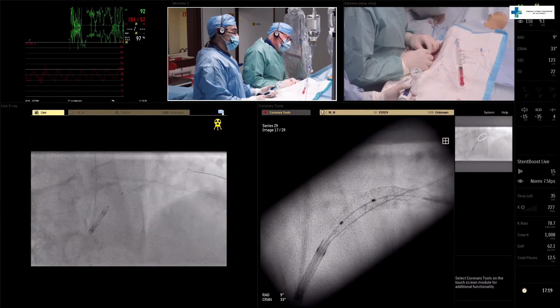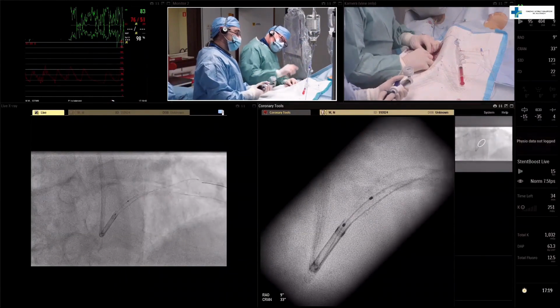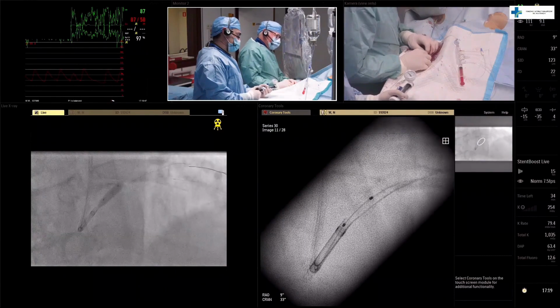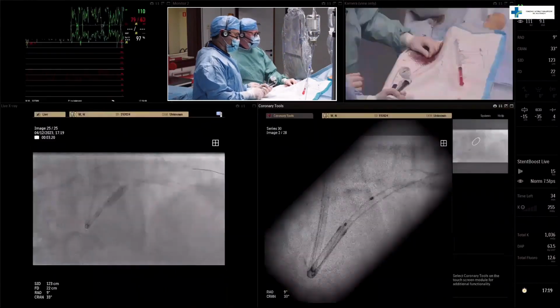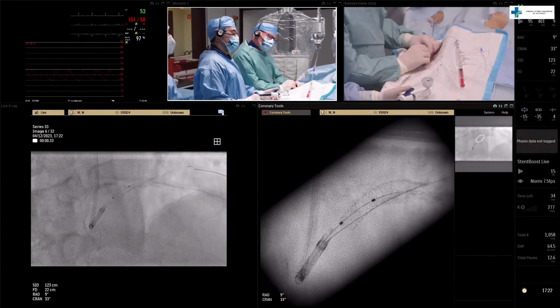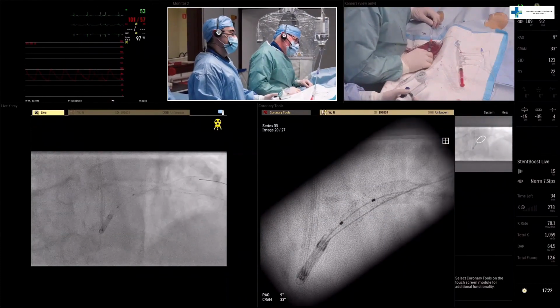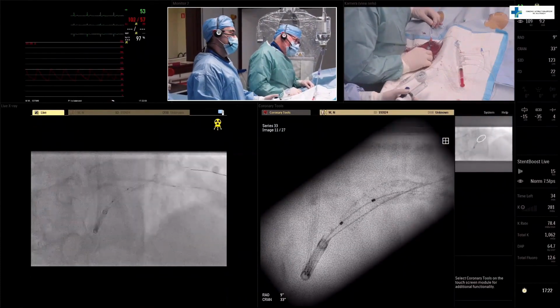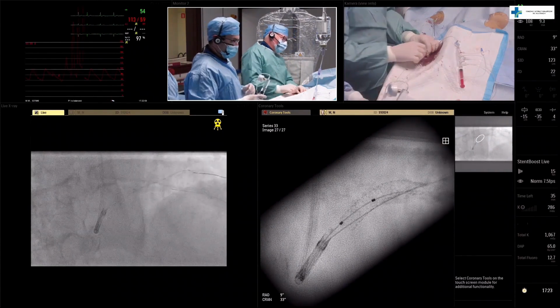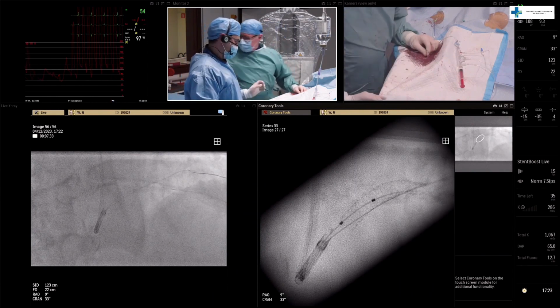And here we can check if we are through the stent. Yes, you see, it's not opened in the ostium fully, so give 18 here in the aorta. So now it's time for stent boost again, and you see that the stent is now very well opened up to the ostium. I will a little bit push the guide, pull back the catheter, and still, of course, we have this trapped wire, so rewiring would be quite difficult.